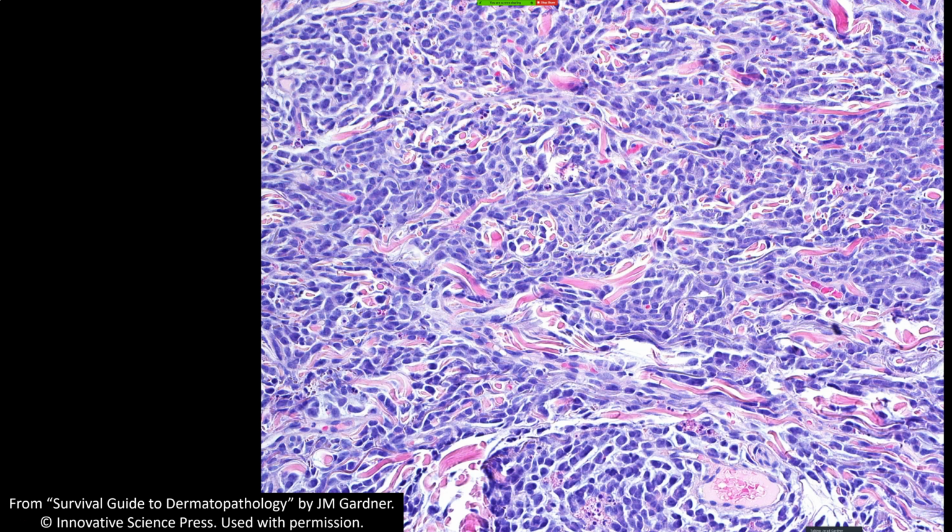I've rarely seen it, but it looks to me just like leukemia cutis, and it'll stain kind of like it, except it stains also with CD56, I believe, and also plasmacytoid dendritic cell marker CD123. Really esoteric stuff. It's a very aggressive tumor and rare, and I think easy to miss if you're not thinking of it. So anyway, you can go and read up about the staining panels. The big thing is if they don't know if the patient has leukemia, and I see this, they need to get a white count right away.